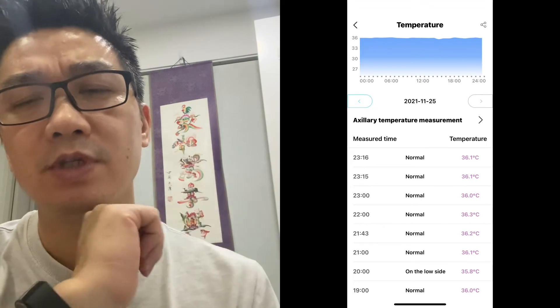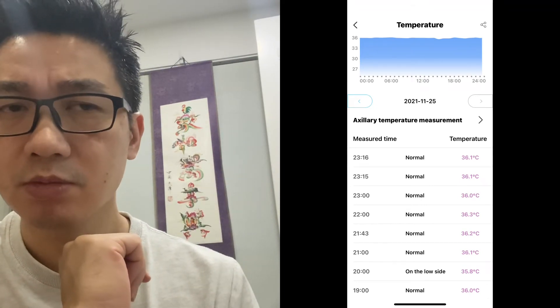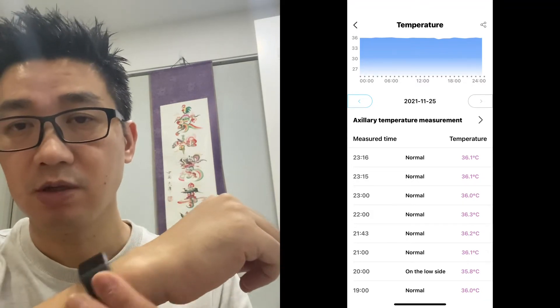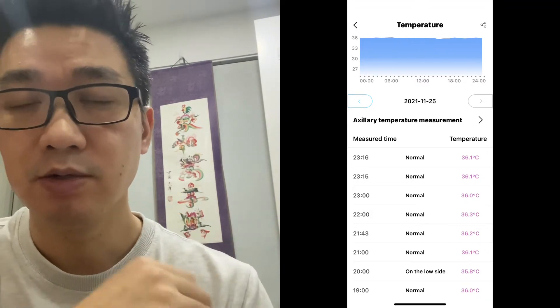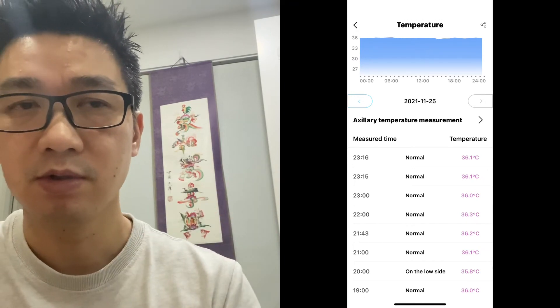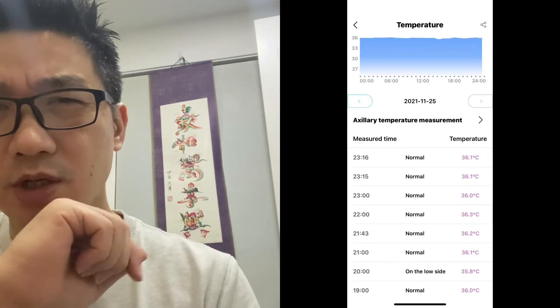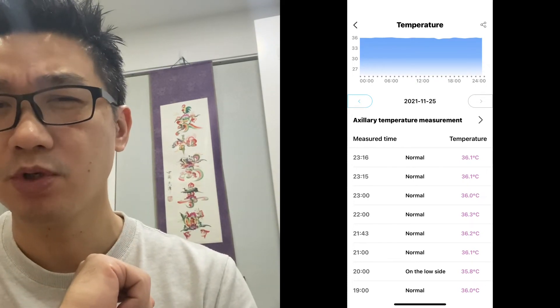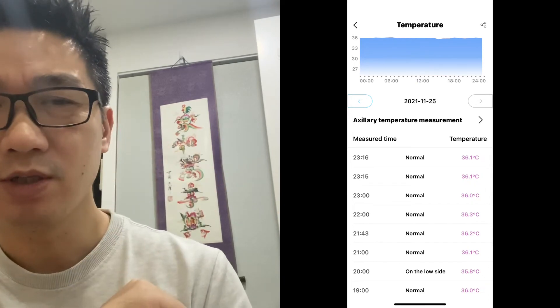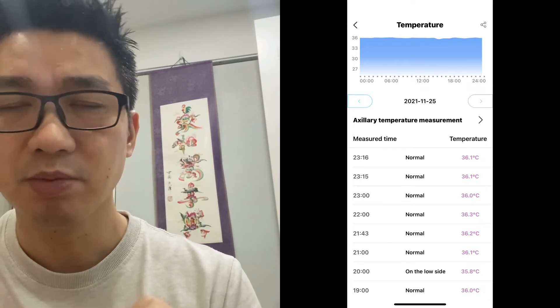One thing I haven't seen in many other devices is temperature. This does skin contact temperature and tells you your temperature through the day — useful for things like COVID or colds. It flags high temperature and even low temperature, though how accurate that is I don't know. It's fun information, but I won't be relying on it.